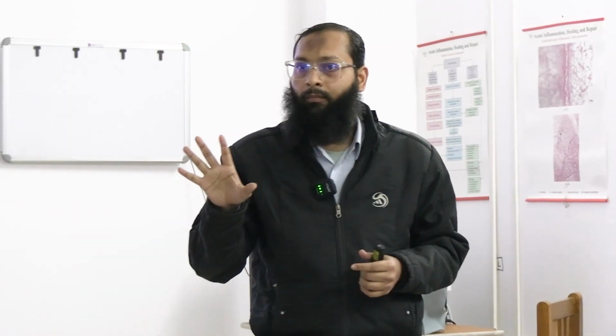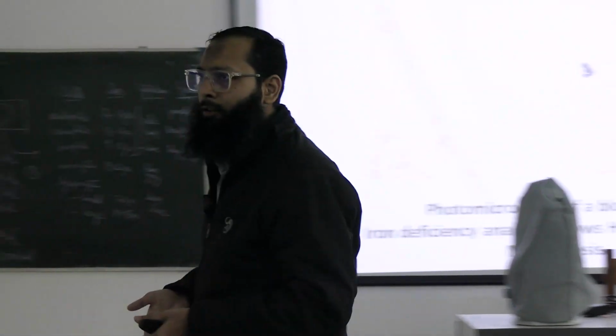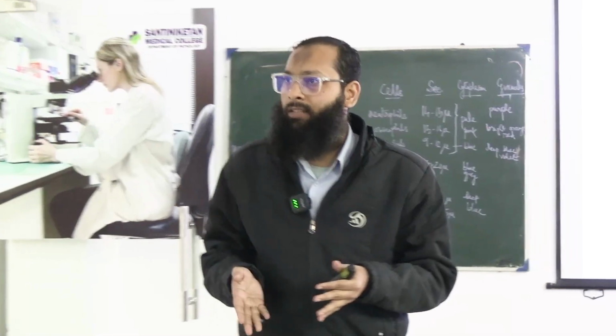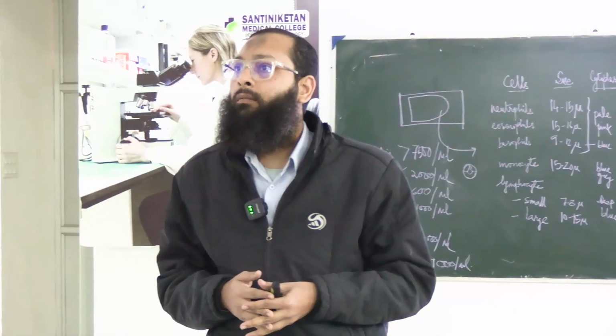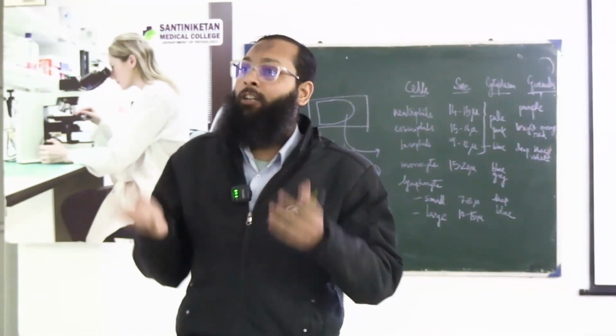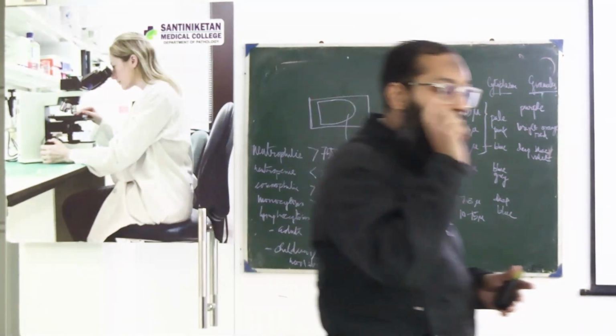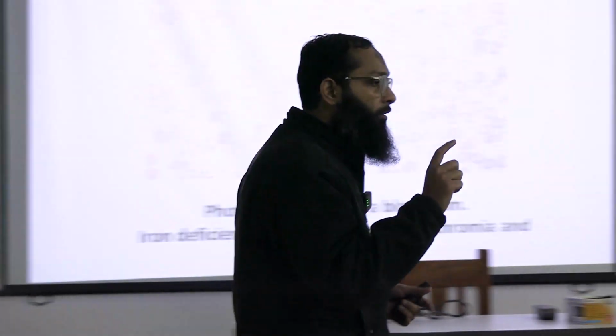Okay? Can you tell me how an RBC is compared? Yes? Just now I told. Are you not listening to the class? Small lymphocyte. Which part of a small lymphocyte? Yes, by the help of nucleus. Sit down. With the nucleus of a small lymphocyte, you are going to compare the RBCs.